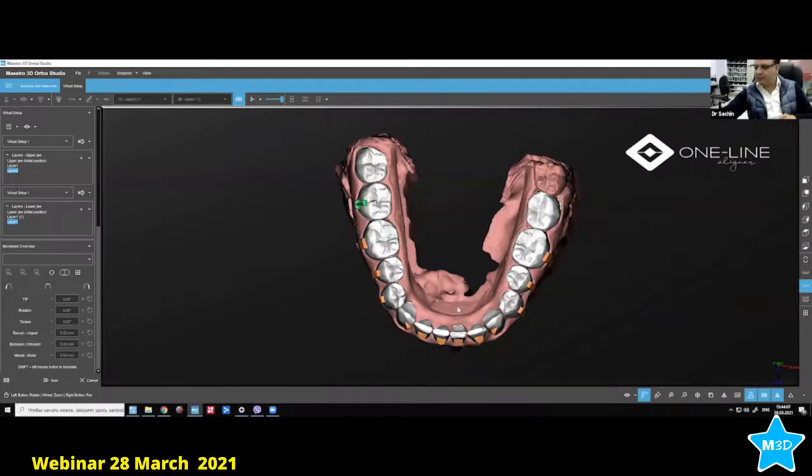So we have a sheet for the technician when we start to make the plan, right? And we have it online also on the database. So we need to write down everything. To avoid too much inventory in the lab, we use right now just one. That is the CA Clear Aligner Pro Plus, which I have seen in my experience works well for almost all kinds of movements. So if somebody is using different kinds of sheets, I do understand the idea, but we just use one kind. As Nicholas from Vietnam also, he's using just one kind, 0.5, which I believe is too thin.